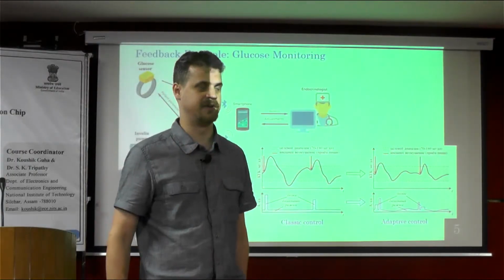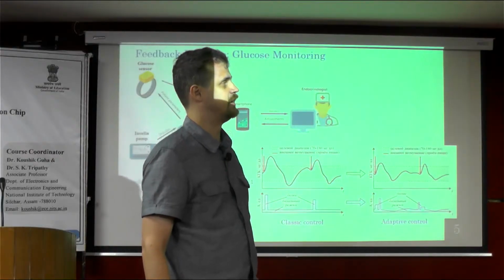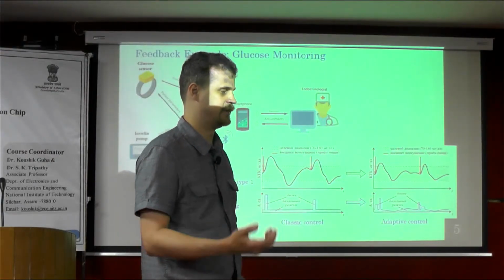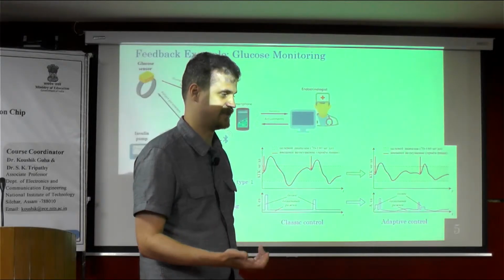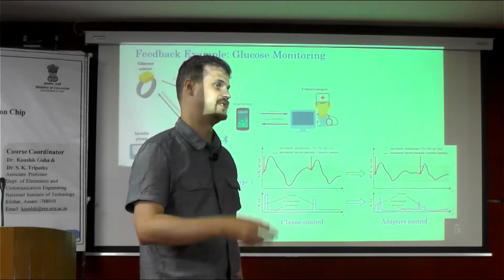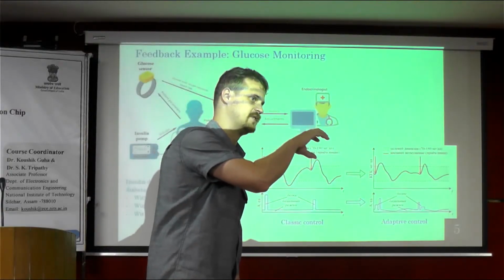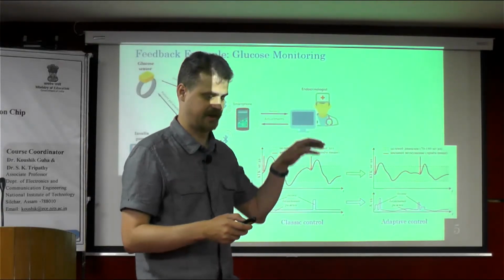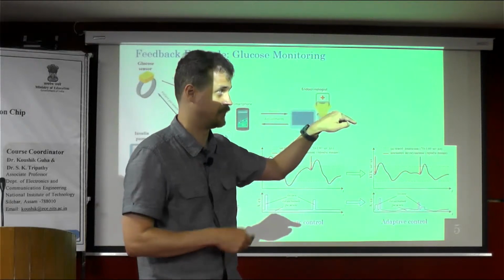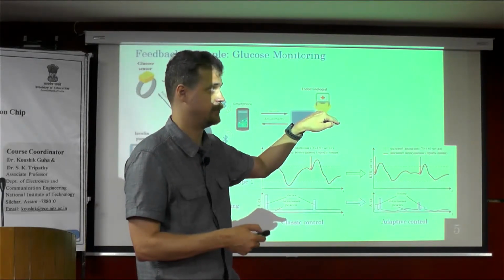That is usually a very expensive way to produce these sensors, and it leads to the complication that we need to immobilize the enzyme on the sensor, and we need to control the stability and the activity of the enzyme, and we need to control the glucose within the microfluidic system.